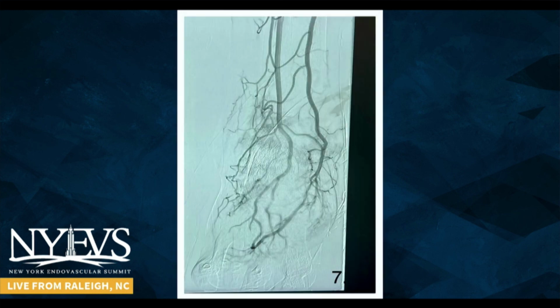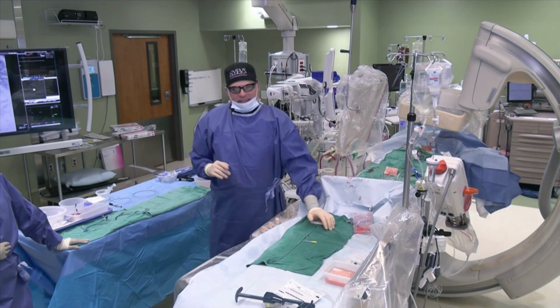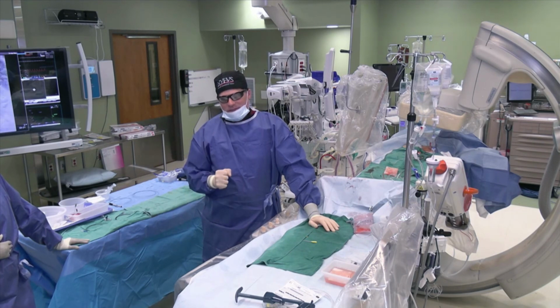And then this is your foot. You can see the actual loop of the anterior tibial and posterior tibial, straight inline flow. And I will tell you that his pulses are bounding. So that's that case. Unbelievable case. Now we have, okay, any comments in regards to ending that case? Because it was a lot tougher than expected.